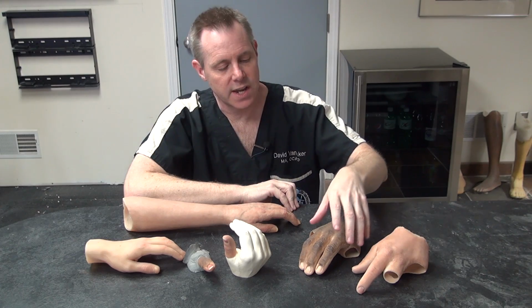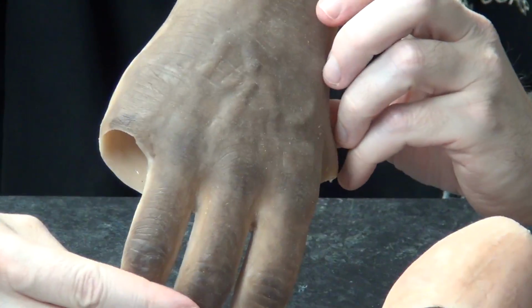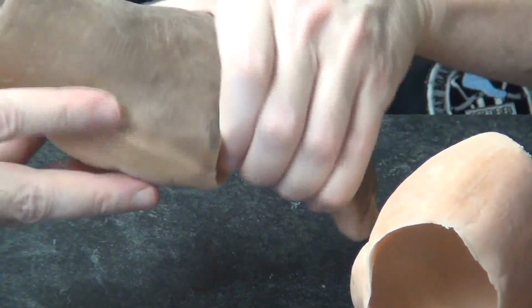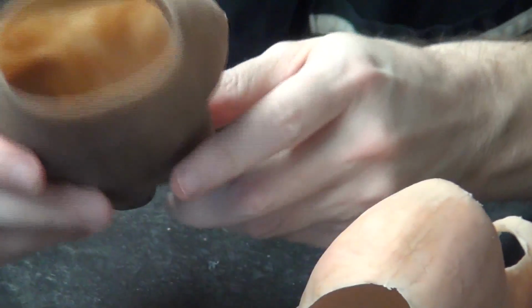In this partial hand here, this is one as it came out of the mold. I haven't done any final painting on it. Actually, this one was a discard because we had some things we weren't happy with. But with this ethnic patient, all these variations that you see here, all of those things, this is how it came out of the mold.